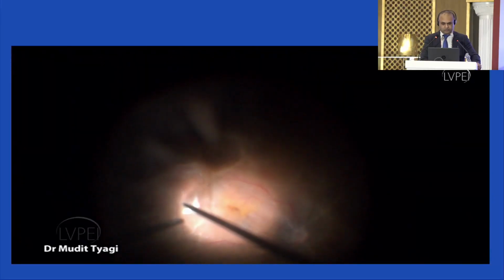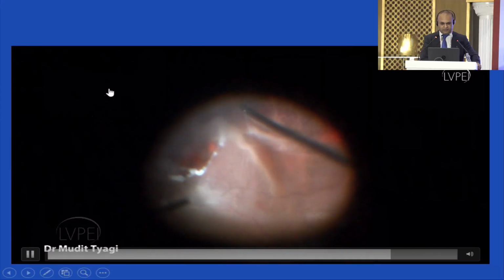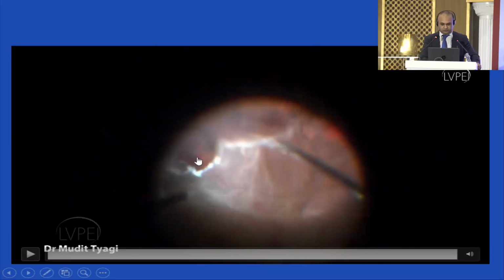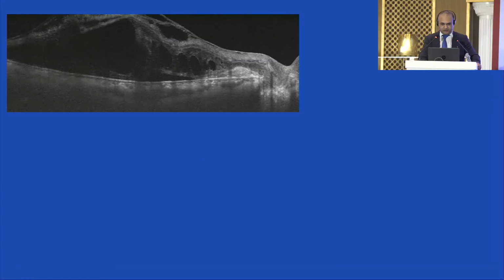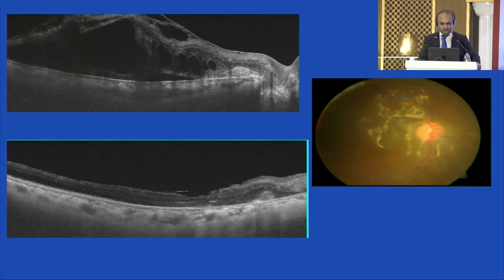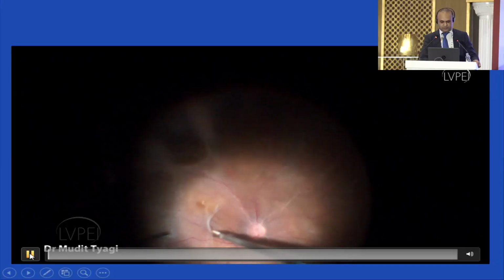Once you remove them, you will be then able to have, like I said, more pliable of a retina over here. You've got a break over here in this area of peripheral necrosis, but you can get away with that. So this is how the patient was initially. This is what the patient became subsequently. And the one video which was not playing, which is basically about where you do a laser, I'll just quickly dwell upon that in brief.